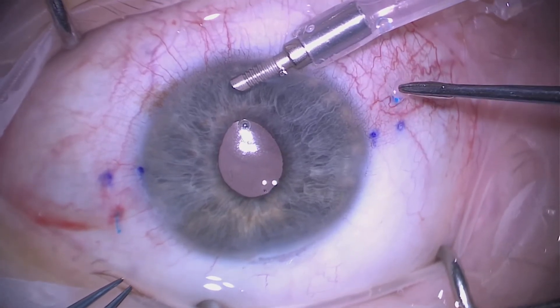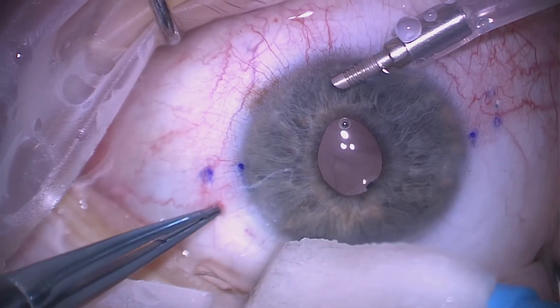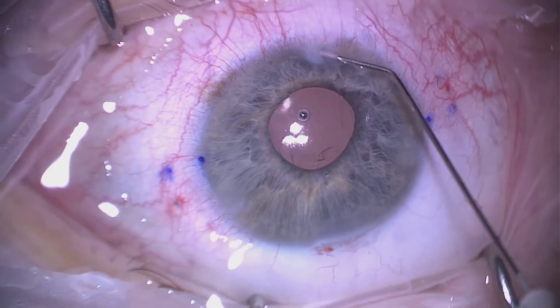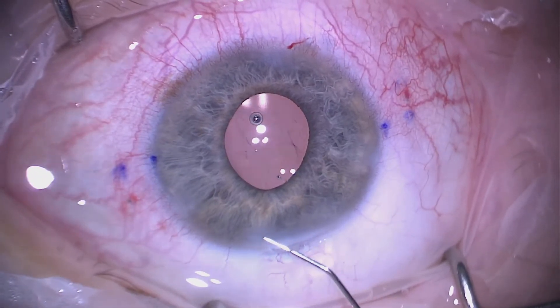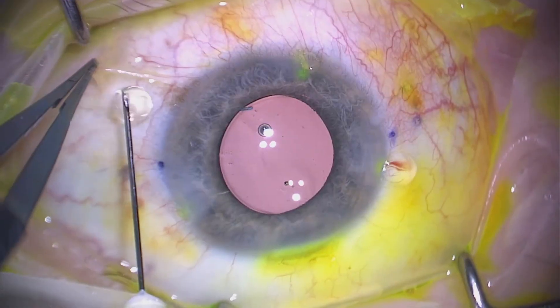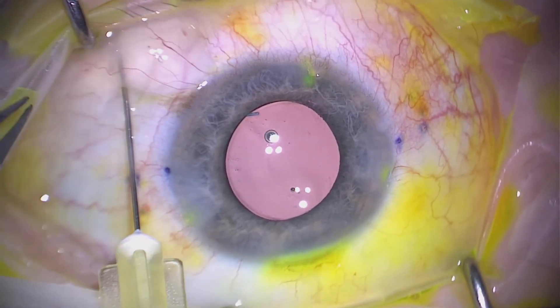We feed one side into the scleral tunnel and then the other, and the lens looks very well centered. We remove the anterior chamber maintainer, hydrate the wounds, and hydrate the main wound. There is a little bit of Viscoat but this should not cause a problem. The lens is very well centered. We check the wounds with fluorescein at the end, and that completes the case. I always like to give subconjunctival antibiotics instead of intracameral, as I think there is a risk of macular toxicity. Thank you very much for your attention.